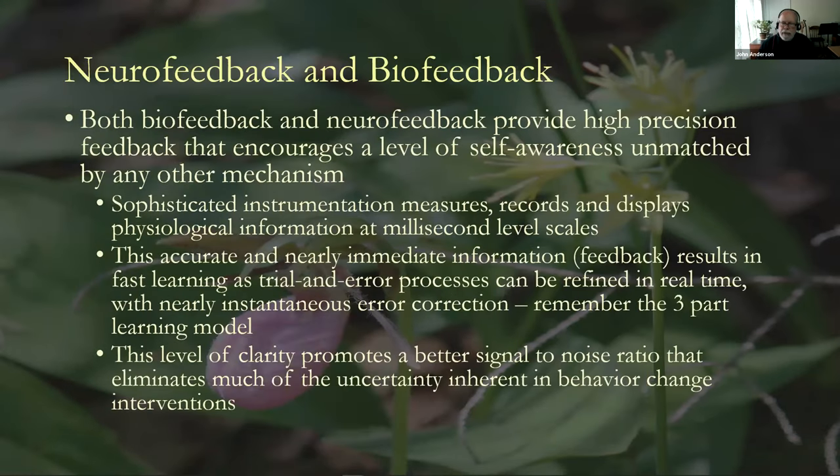So neurofeedback and biofeedback in general both provide this high precision feedback that encourages a level of self-awareness unmatched by any other mechanism, mostly because it's so fast. Sophisticated instruments provide information about activities that are going on that otherwise would be non-conscious, non-cognitive, and they do so at millisecond scales.